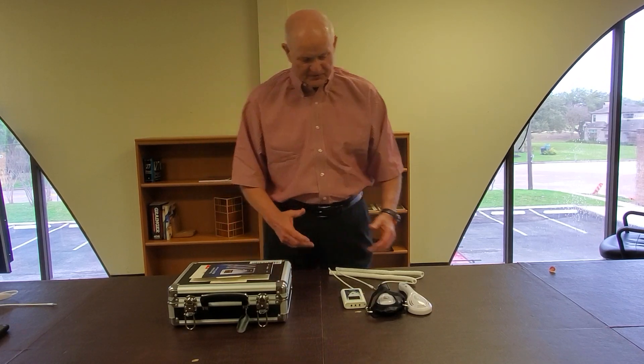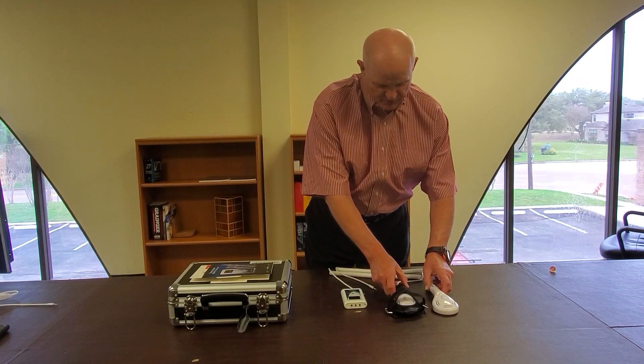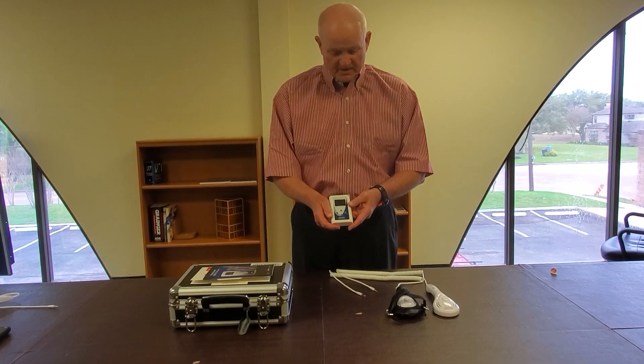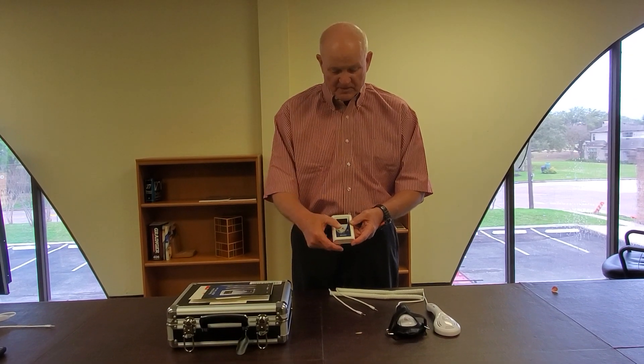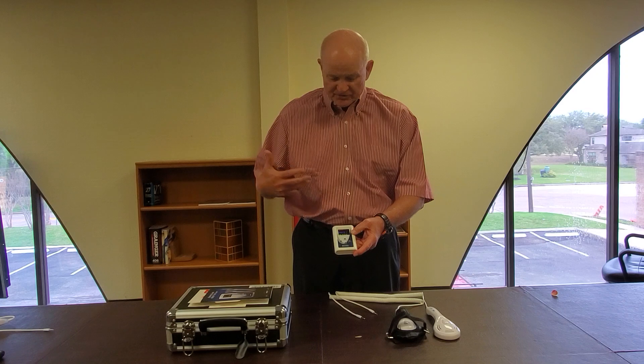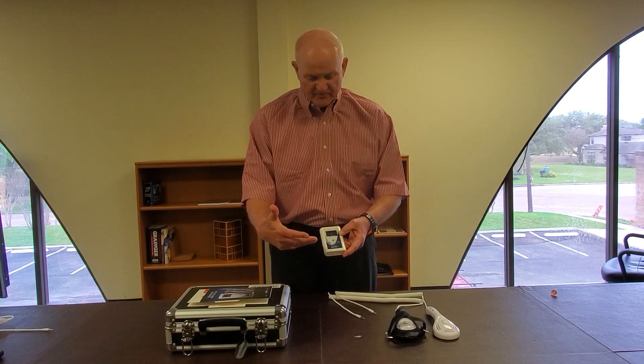Now let's go to the actual laser and power source. This is the console, and you activate the console by hitting the six o'clock button. That turns everything on. You'll see it light up and you'll hear a little bit of a beep.